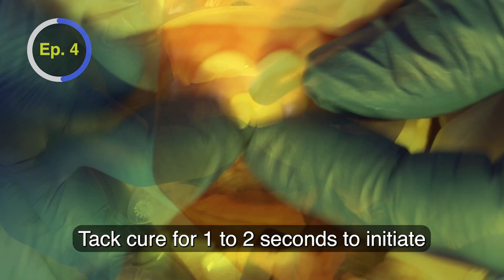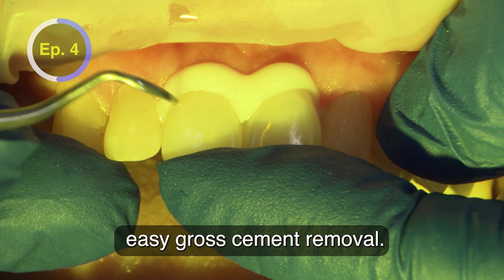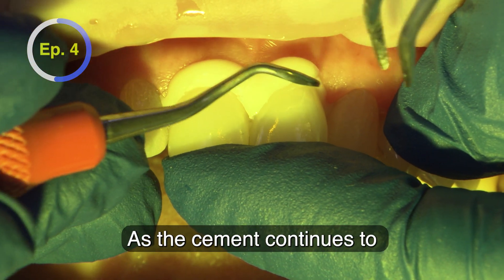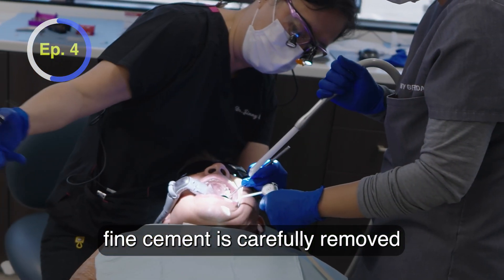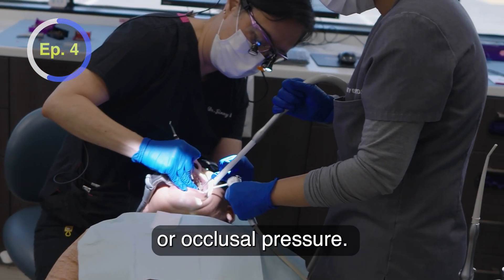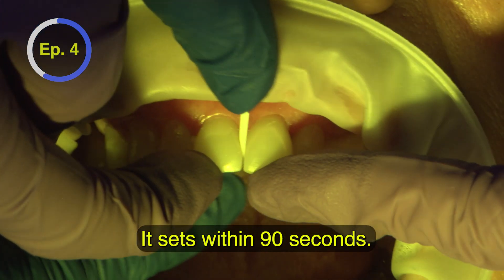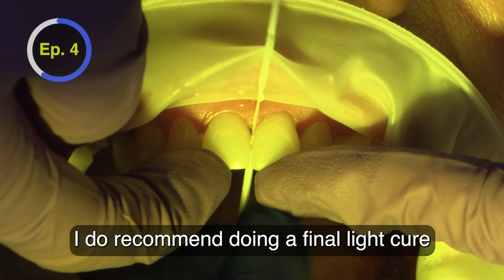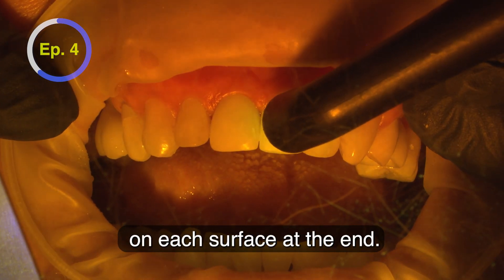Tack cure for 1–2 seconds to initiate the gel-like state for easy, gross cement removal. As the cement continues to set on its own, fine cement is carefully removed while still providing incisal or occlusal pressure. Without light curing, it sets within 90 seconds. A final light cure for 20 seconds on each surface is recommended at the end.